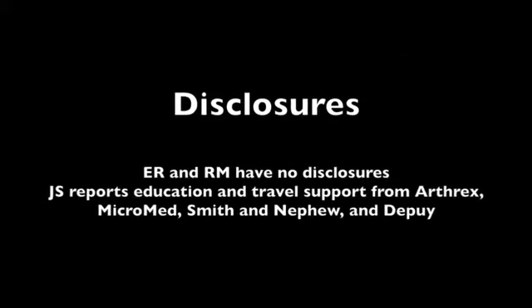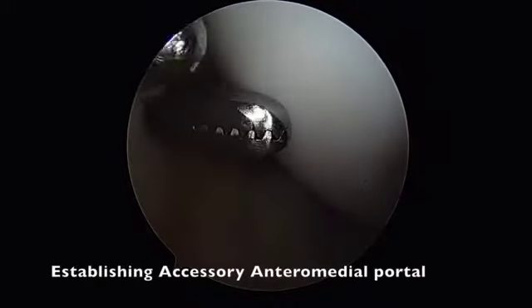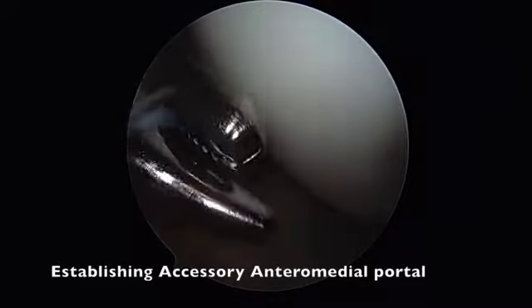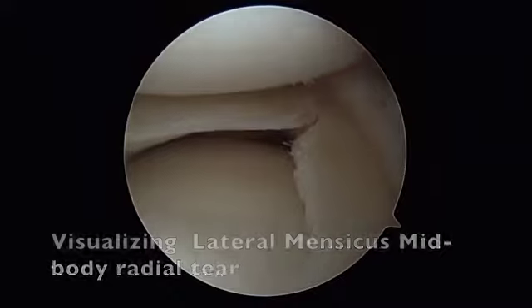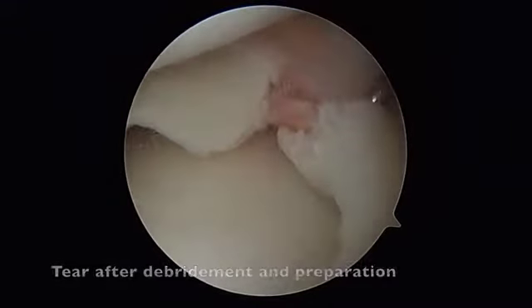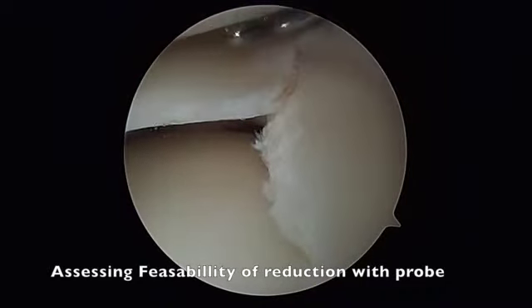Once the tear is identified and diagnostic arthroscopy is completed through standard anteromedial and anterolateral portals, the accessory anteromedial portal is established just medial to the anteromedial portal. The leg is brought into a figure-4 position for access into the lateral compartment of the knee, where the tear is debrided to create confluent edges to facilitate edge-to-edge repair and enhance healing.